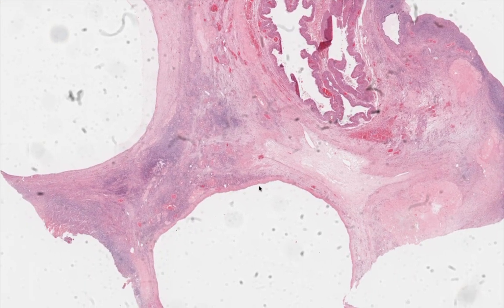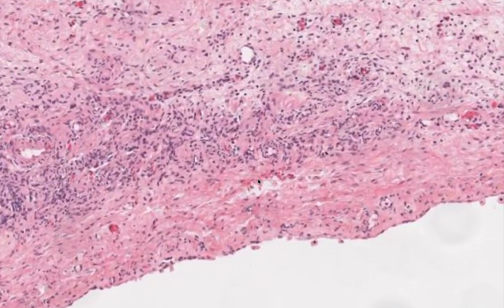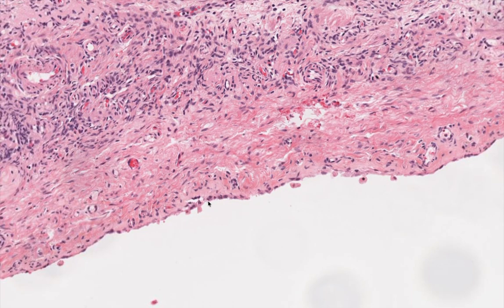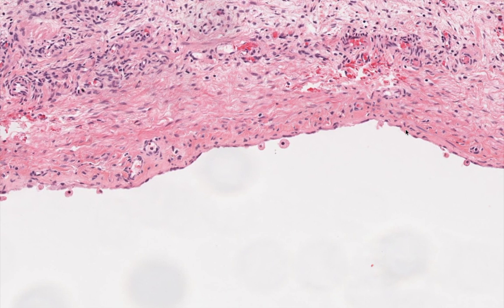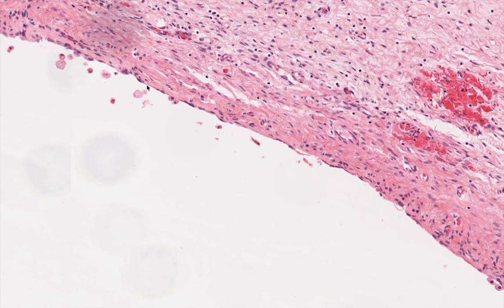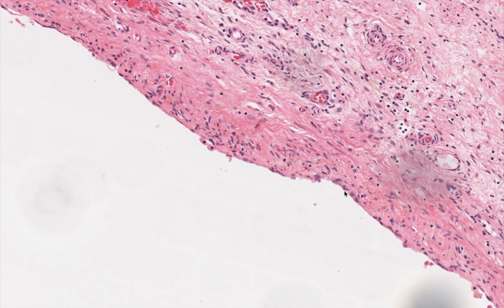Let's have a look over here. What have we got? Okay, so now we've got another cyst, and that is lined by little cuboidal epithelial cells, and there aren't any granulosa or thecal cells there. So these are flattened cells, and I would think that this is a serous cystadenoma in which the cells have become very compressed. There are some macrophages here.